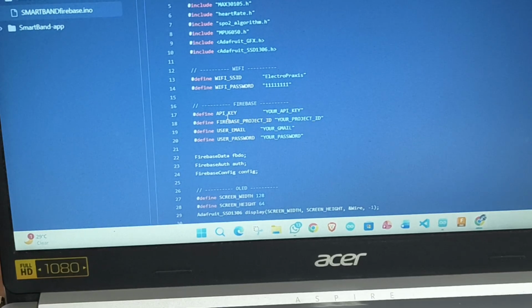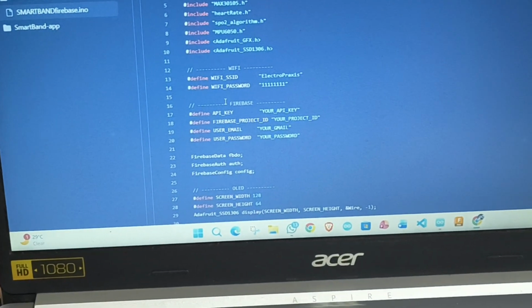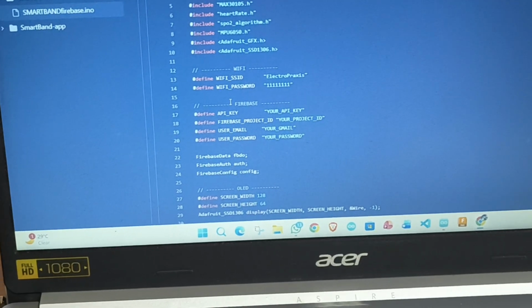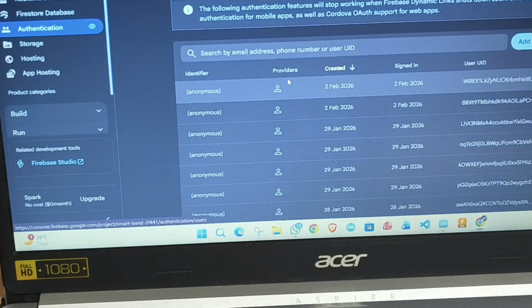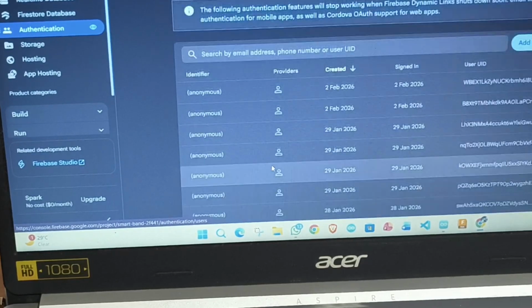For Firebase, when you create your project and your web app, Firebase will provide you the API key, Firebase project ID, a user email, and a password, which you can also make directly in authentication. So I have this anonymous username. Also, I have created one username using my Gmail.